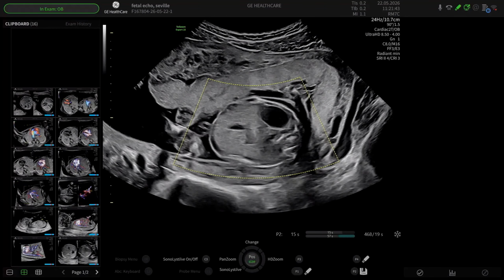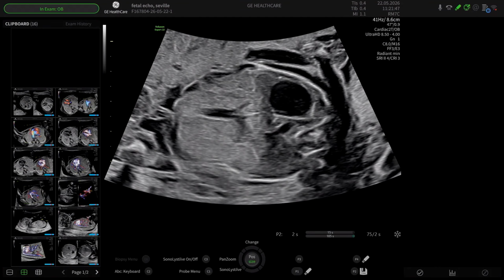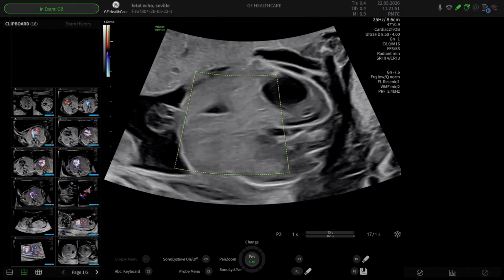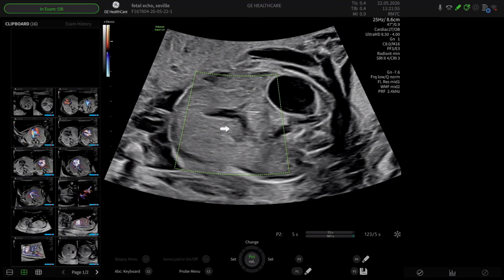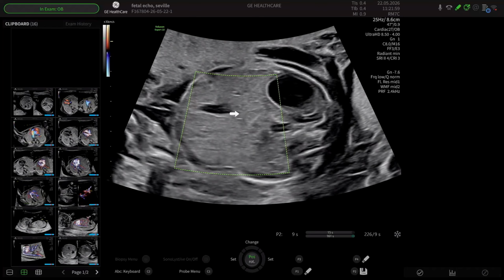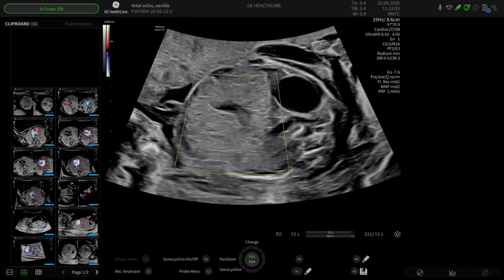I omitted in my previous talk about coming back. I said I'd come back to the first section, but this is where you're looking at the intrahepatic vein. So in the first section, the intrahepatic vein curves away from the stomach. Now you can see straight away that I'm getting no fill. Now, does anybody know why I'm getting no fill? The answer is because my PRF is set at 30 centimeters a second.